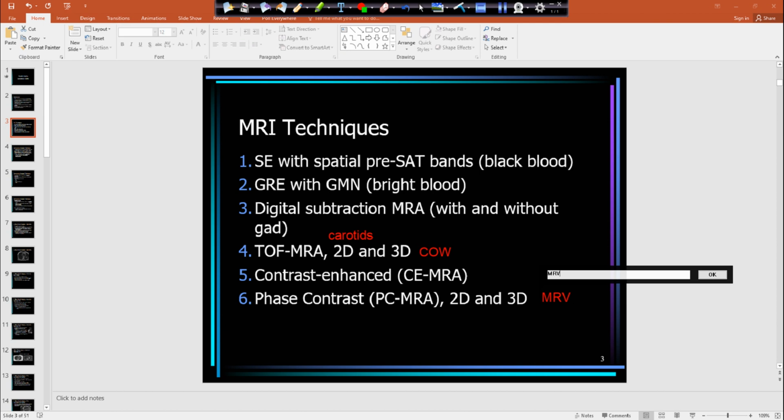Yeah. It's usually just one sequence. We get a localizer and then we just use it. Usually it's a 3D image of the entire brain, and we see that superior sagittal sinus, which is a venous structure, in profile. It's a really pretty image. So they're looking for any type of thrombosis or blood clot within that venous structure.